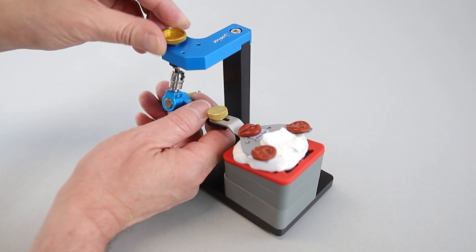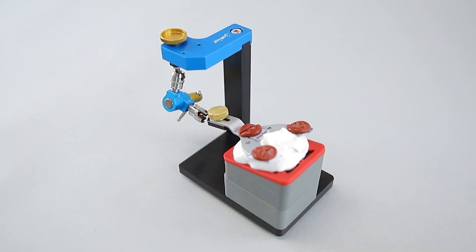Take care that the position of the bite fork doesn't change during the fixation process, and that the bite fork is in solid contact with the plaster. Now wait until the plaster is hardened.